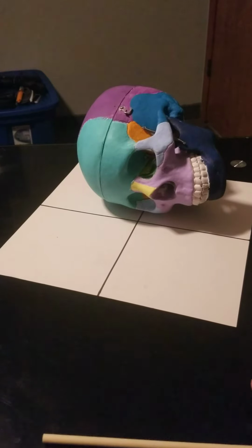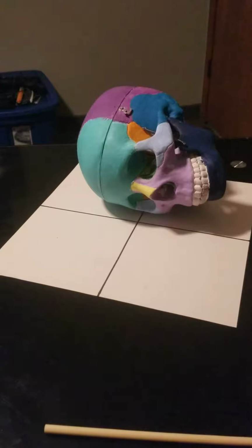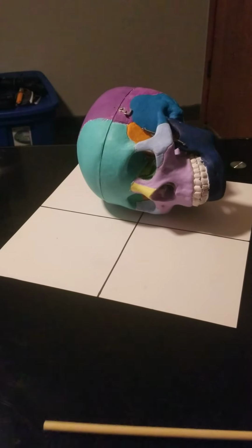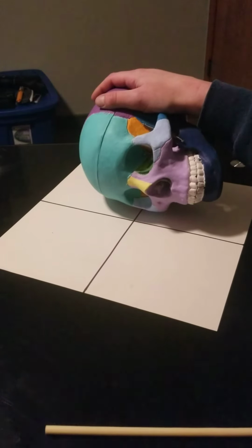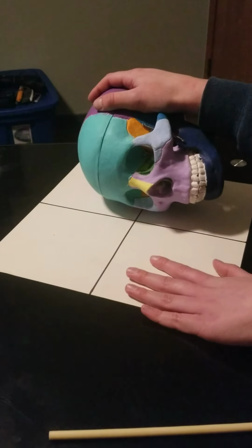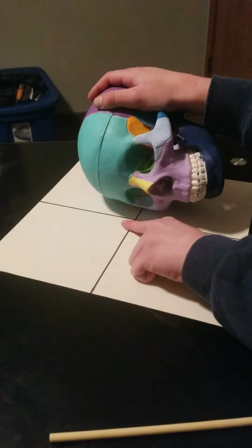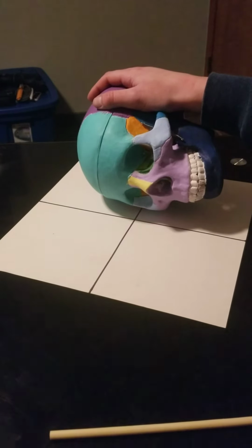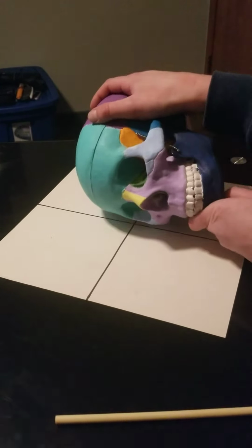For my next projection, I'm going to do the lateral orbits. For this projection, again, I'd want my patient in the anterior oblique position on a 10 by 12 crosswise IR. I'd want the affected eye closest to the IR, and I'd want to center my IR to the outer canthus of that affected eye, so right about there.